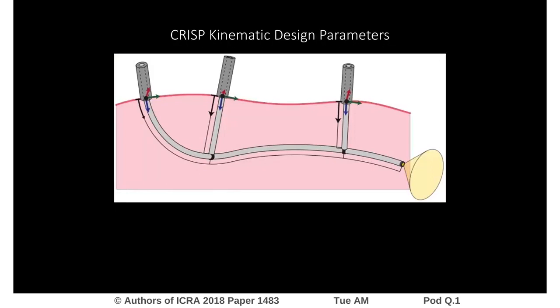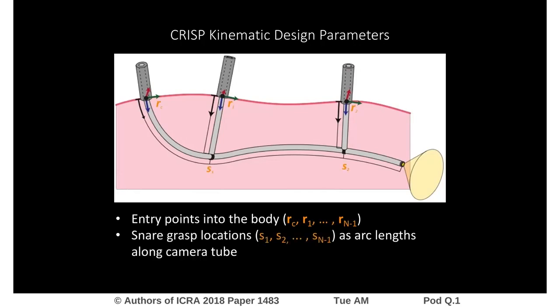We consider the optimization of a set of kinematic design parameters for the CRISP robot that are set prior to the surgical procedure. These parameters include the entry points where the tubes are inserted into the patient's body, as well as the snare grasping locations which dictate the parallel structures of the CRISP robot inside the body. It is important to consider these parameters as they can greatly affect the ability of the robot to visualize patient anatomy.